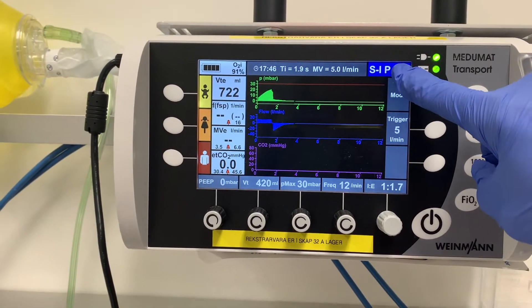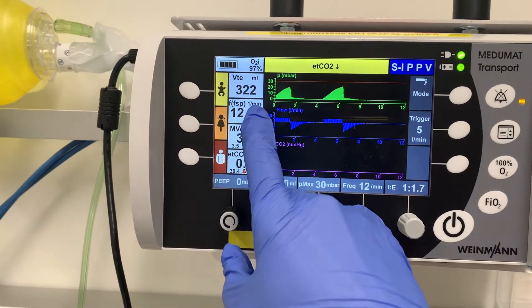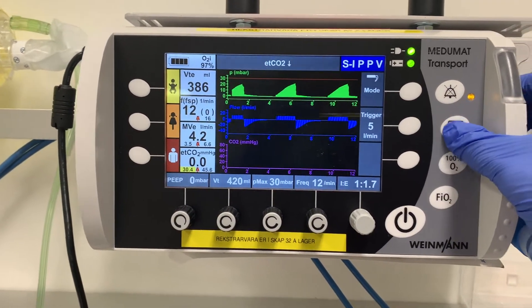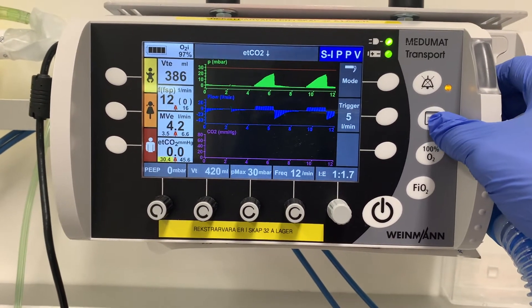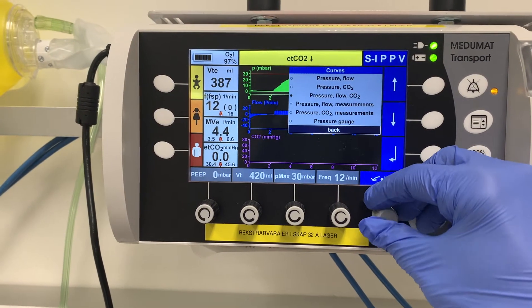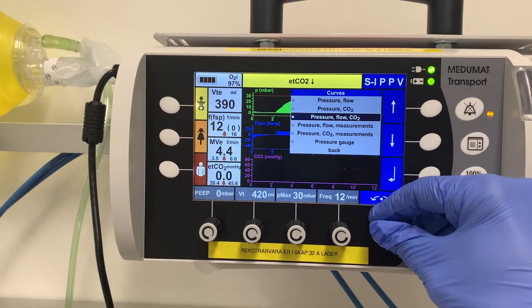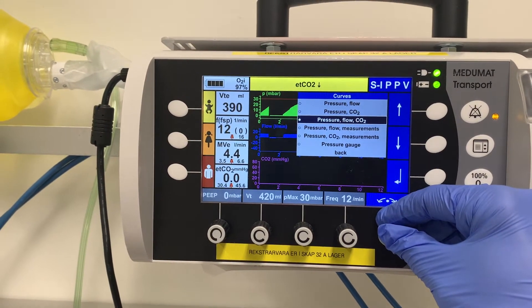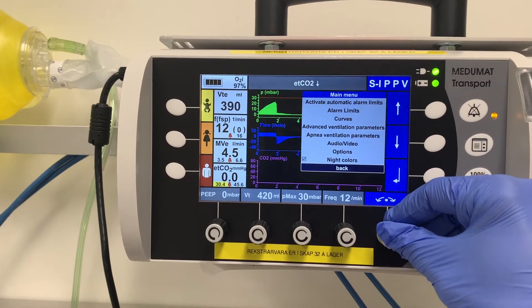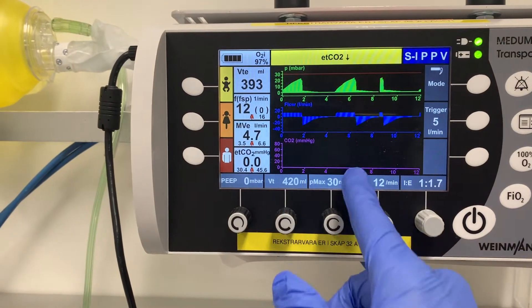Now we have the mode displayed in the upper right quadrant. We have pressure, flow, and CO2 waveforms. If you want to change the display, go into the menu, then 'curves,' and choose pressure-flow or pressure-CO2. I like to have pressure, flow, and CO2. Then go back.